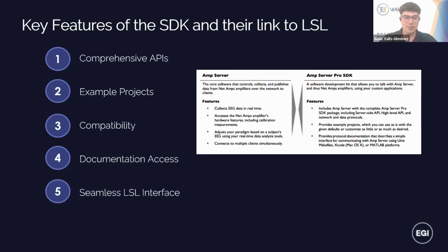And this connector essentially bridges these two things, the LSL framework with the SDK. It takes care of all of this communication for you, so instead of having to dig into it directly, you get a straightforward way to start streaming your data. From there, you can focus on whatever your actual project needs are, regardless of your coding background.